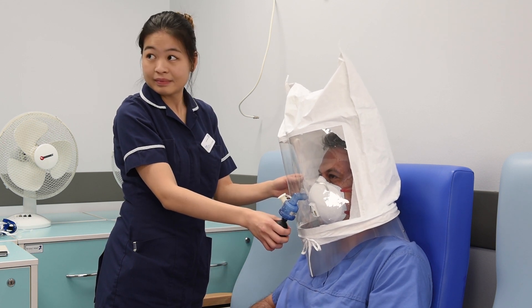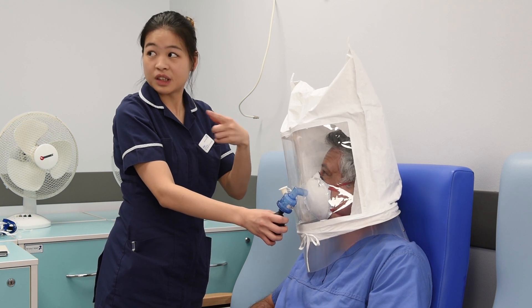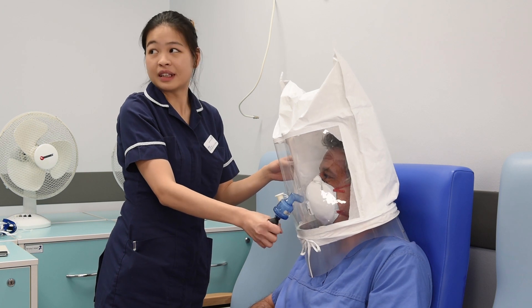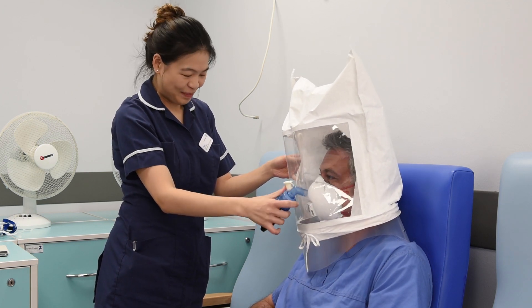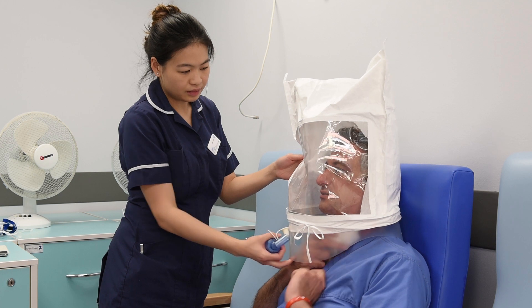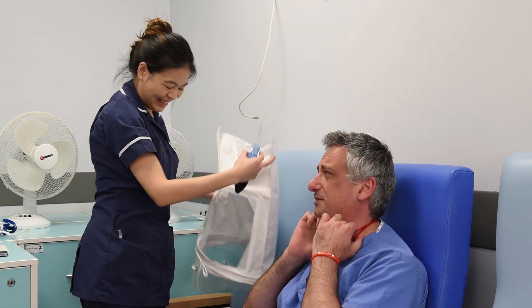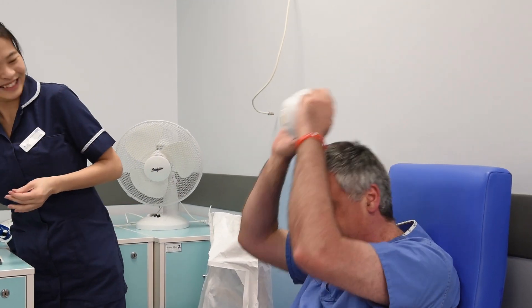Can you smell it now? Can you taste it? Not right now, but after a few tests — usually by the third or fourth — I go home with that taste. Just take the mask off under the hood. Oh yeah — definitely not a good taste. I definitely didn't have that before. Congratulations, I think I passed. You passed!